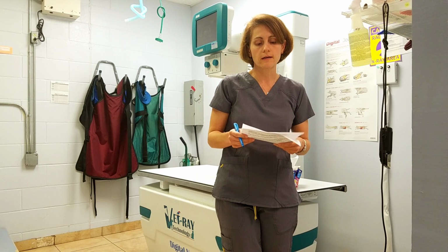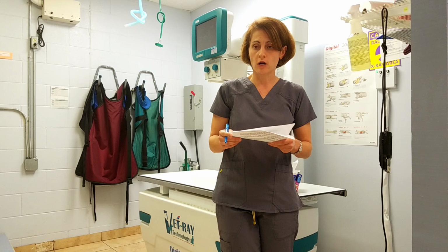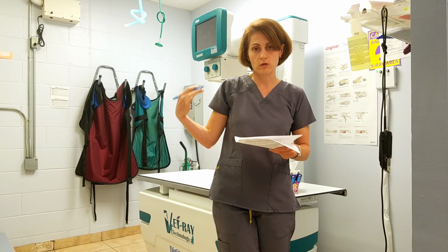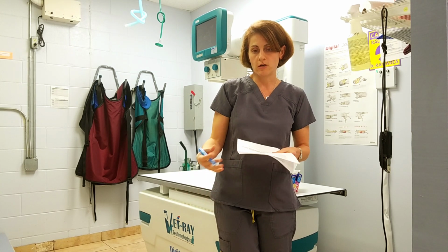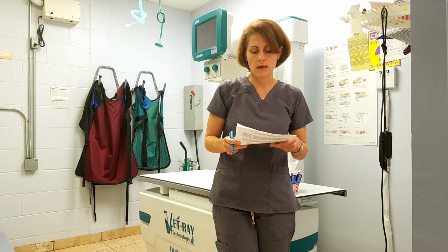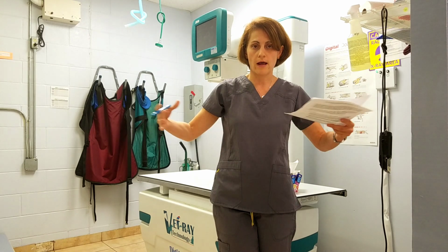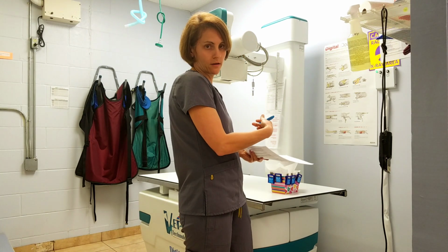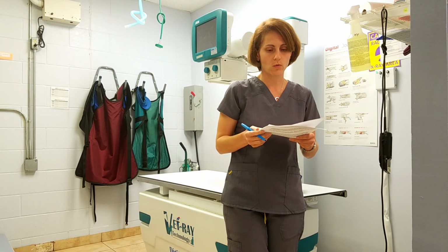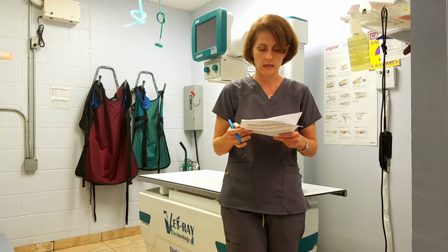Using a technique chart. All of our x-ray machines have a built-in technique chart. So we need to make sure we're selecting the right technique within the software, and that helps reduce the amount of radiation that's generated by using just the right amount, but no extra. Restricting the alignment of the beam. So that's collimating down, shooting just over the area we're interested in, which allows us to get the technicians taking the films further away from the radiation beam. So we want to basically shoot over the area we care about, not just a big wide area scattering more radiation than we really need.